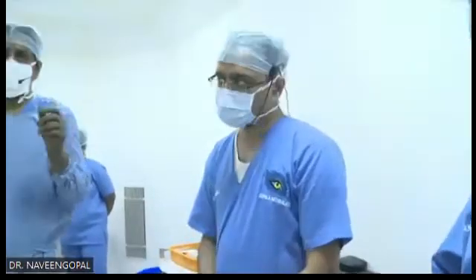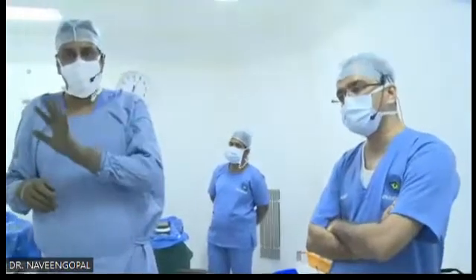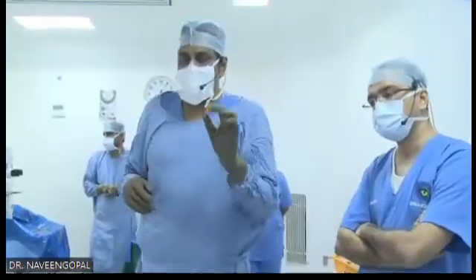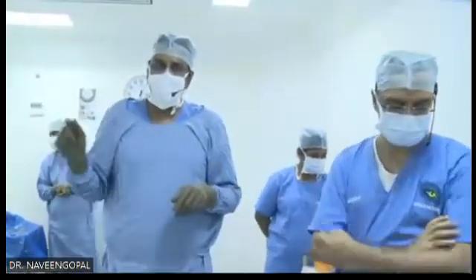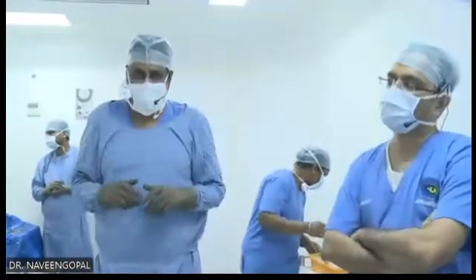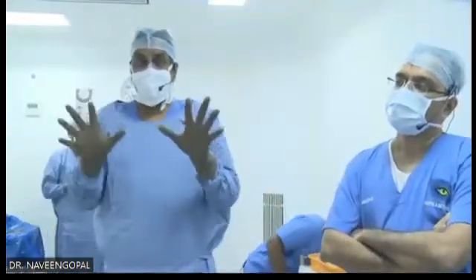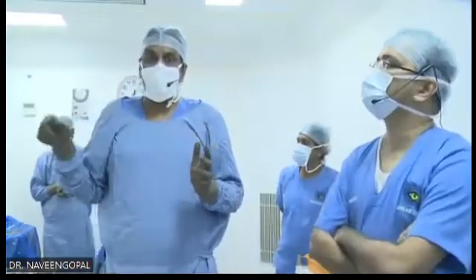I agree with him. Star ICL is slightly thinner than all our Indian phakic lenses. For star ICL I keep the cutoff at 2.8, but for Indian ICLs I keep the cutoff at 2.9 or 3. 3 is very safe. Also check the angles; they should be open in all four quadrants.